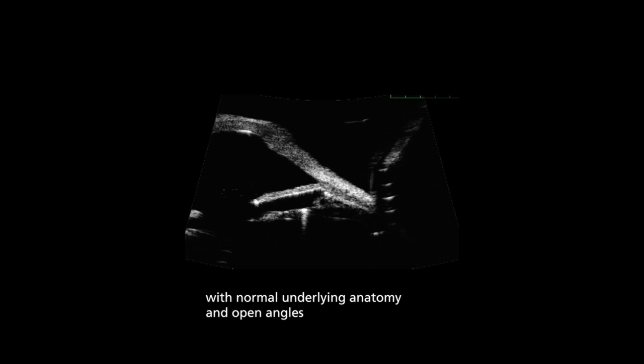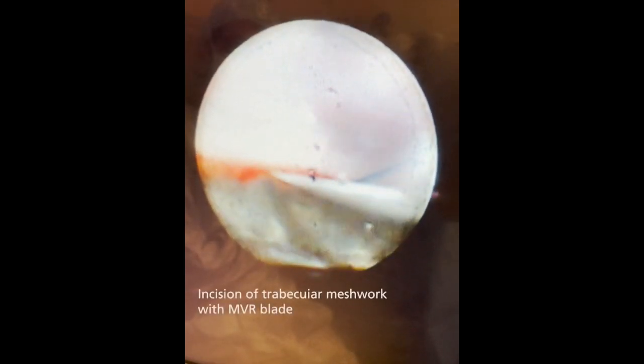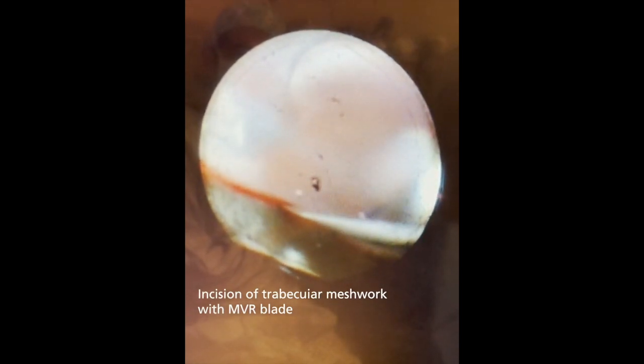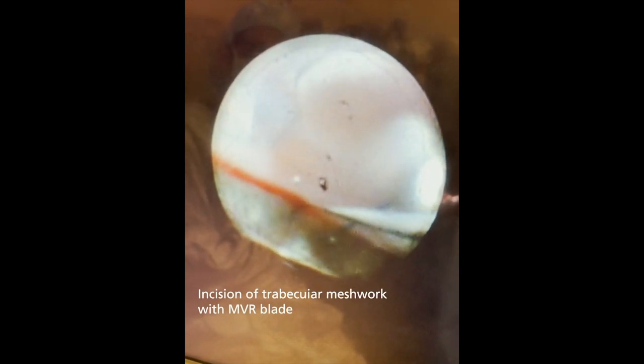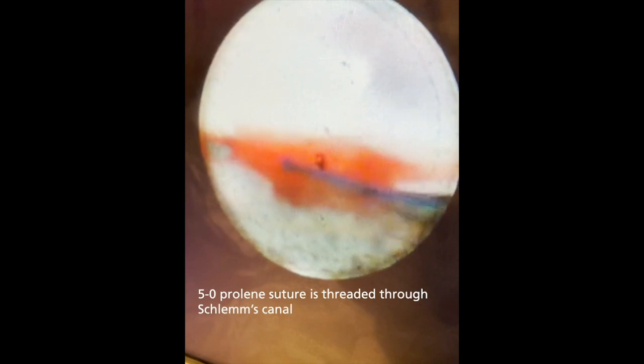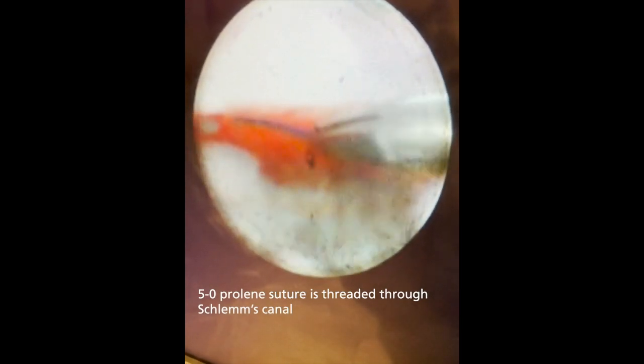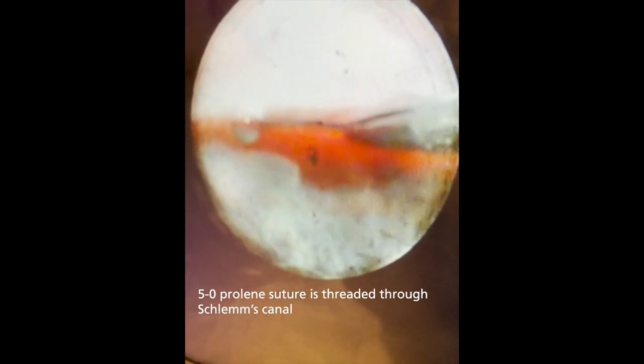You can see here from this UBM that remarkably, despite his complex history, his angle anatomy appeared reasonably open. So we took an 18 gauge probe and were able to visualize the angle anatomy and make a small goniotomy here with an MVR blade and feed a melted tip 5-0 Prolene through the trabecular meshwork and into Schlemm's canal.